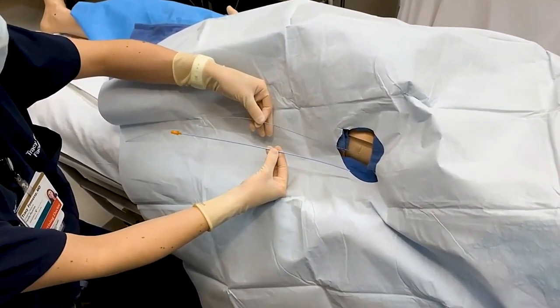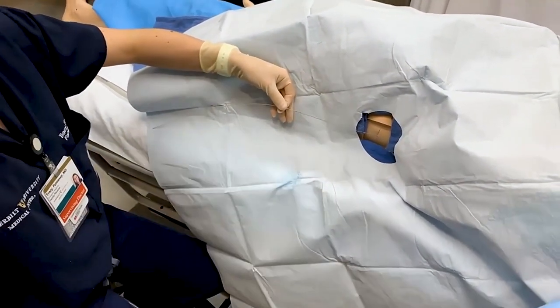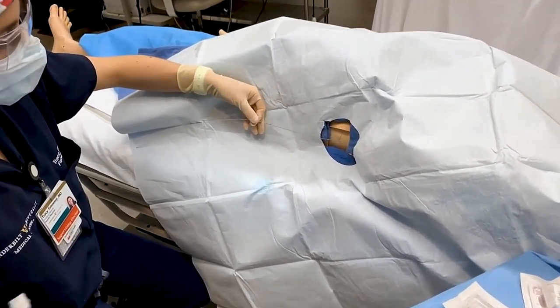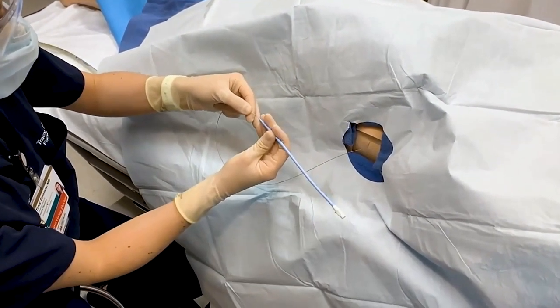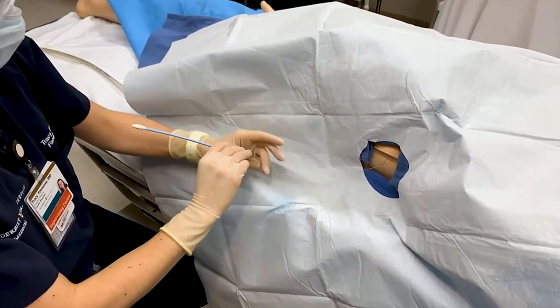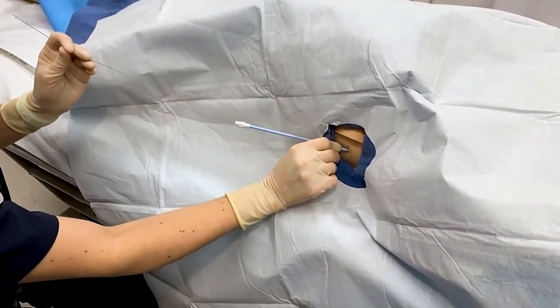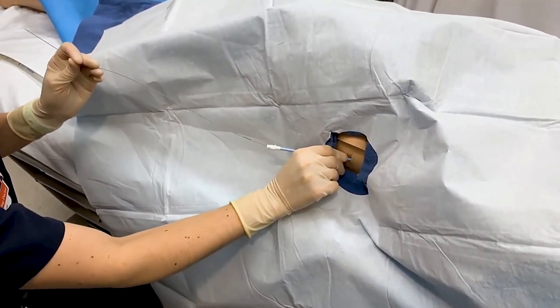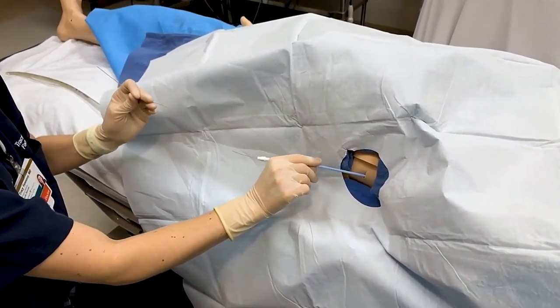Next, you have a small dilator and you can use that to do your first dilation. There is also a larger dilator that you can go straight to. Go ahead and twist as you are putting the dilator into the chest wall, keeping your wire in place. Now that you've dilated up, bring that off.